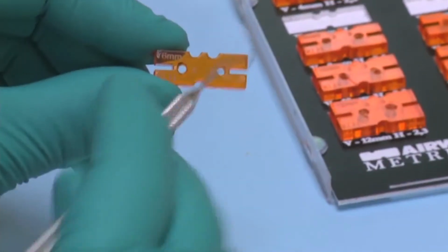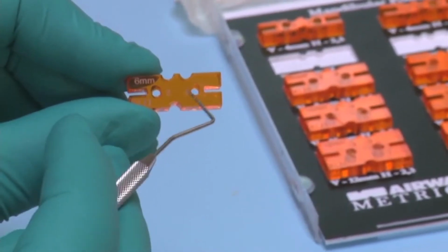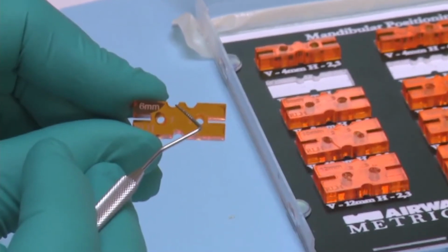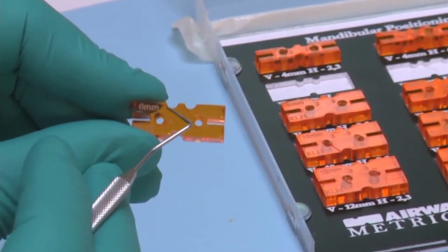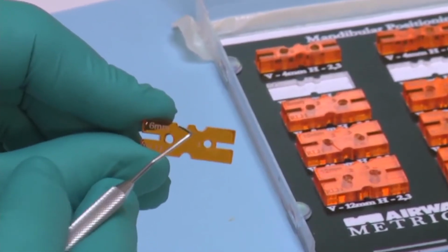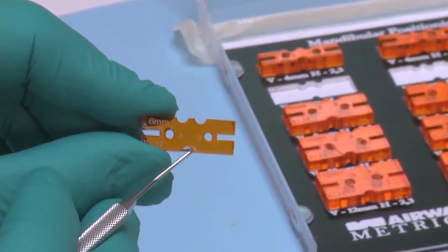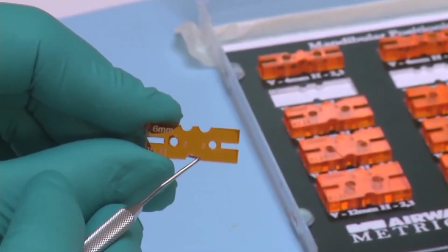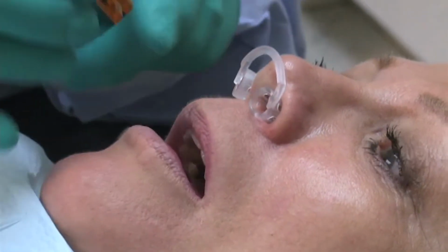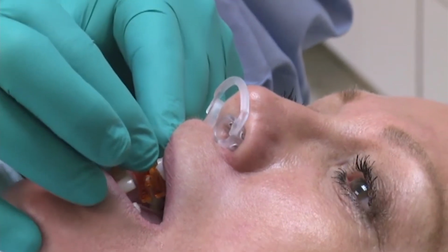This is our 6 millimeter vertical key, and you'll see the number 2 and the number 3 here. We're going to try 2 millimeters of horizontal advancement at 6 millimeters vertical. So this notch goes on her maxillary anterior teeth, and she will move her mandible into this lower notch, and that will be 6 vertical, 2 horizontal, and let's see how she responds. So we'll put the 2 notch over her maxillary anteriors, move into the lower notch.